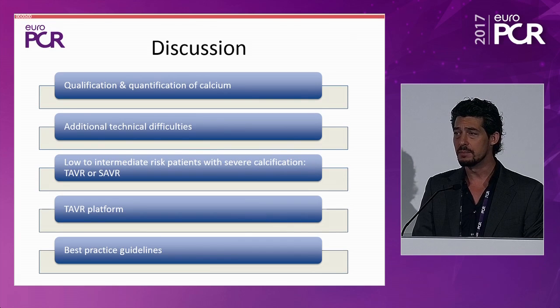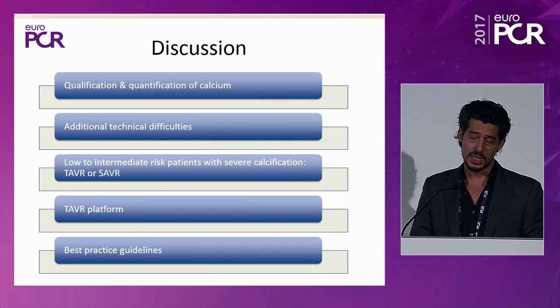Lastly, perhaps we can think about some best practice guidelines to treat patients with severe LVOT calcification.